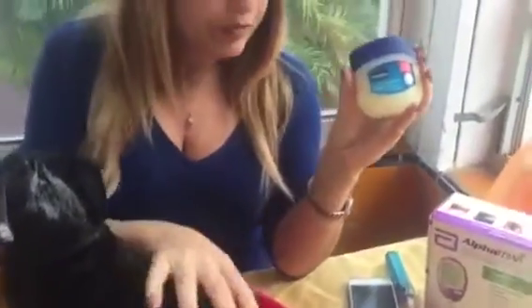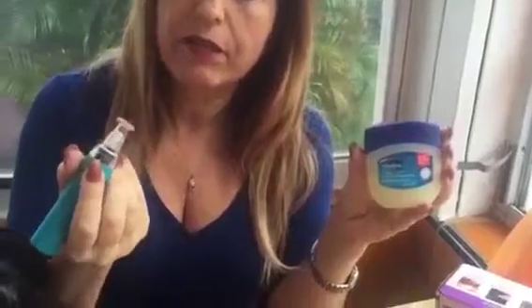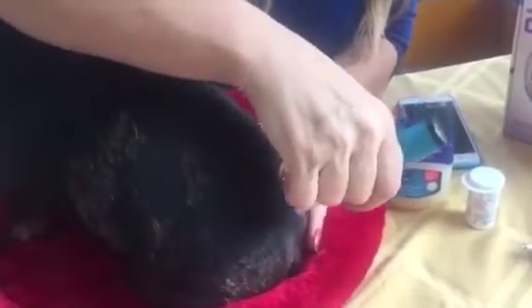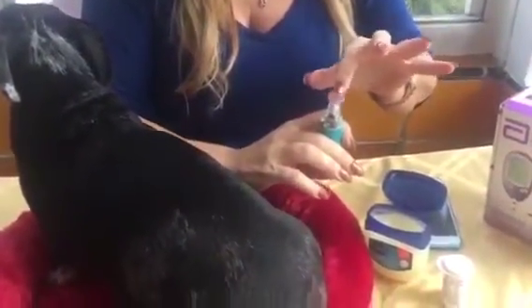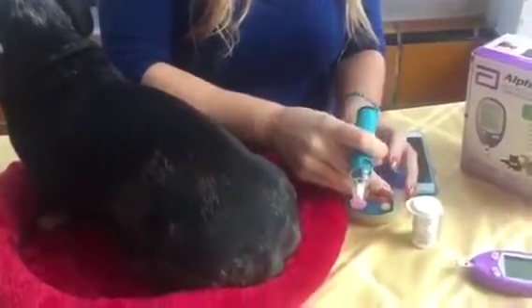The reason I have Vaseline over here is because it's very important when you use the Gentile that you have the appropriate amount of vacuum. Sometimes because dogs have all the hair around this area, you want to make sure that there is no air coming through. So sometimes what I do, I take just a little bit of Vaseline and put it around the top just to make sure that there is no extra air coming in when I check his blood.